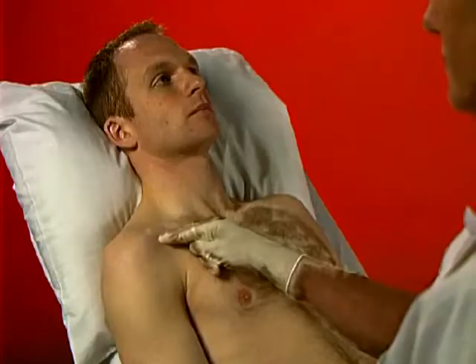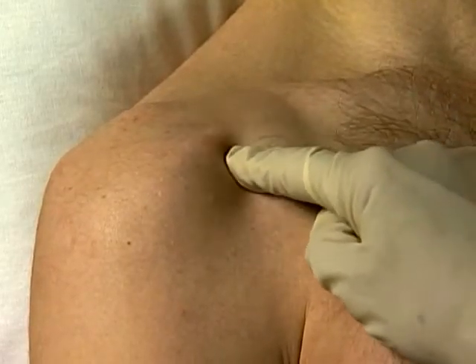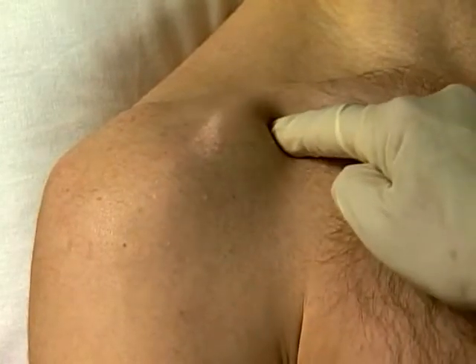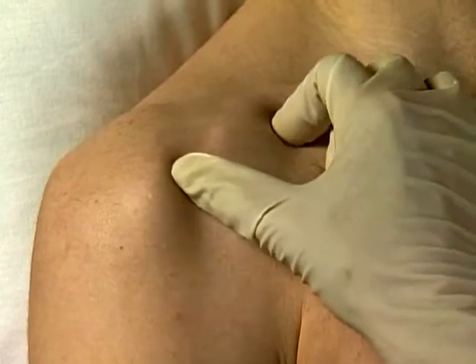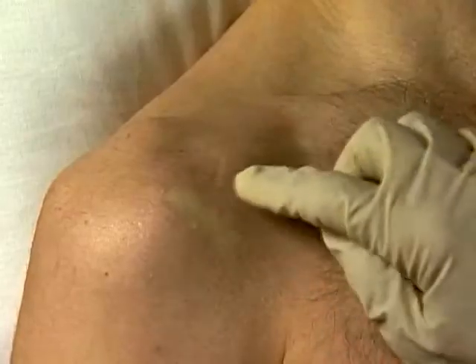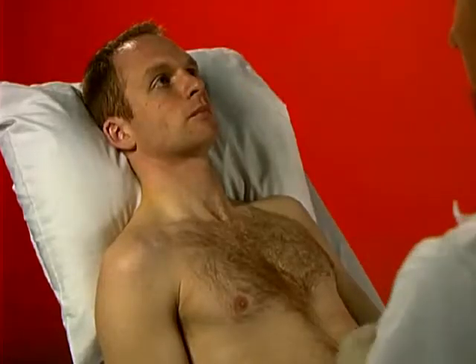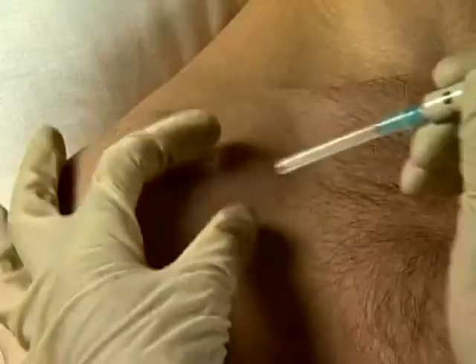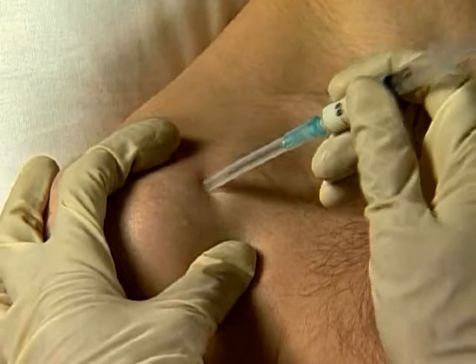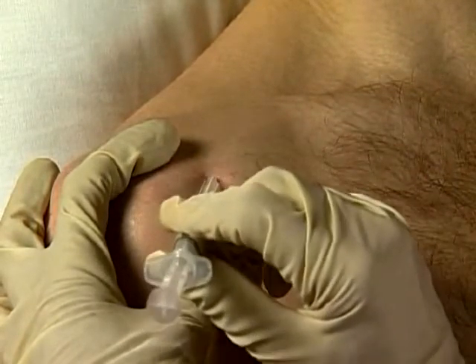3 areas can be injected from the front of the shoulder: subscapularis tendon, the bursa, and the shoulder capsule. Identify the coracoid process lying anteriorly and the lesser tuberosity on the humerus. Mark entry point immediately medial to this, clean and firmly stretch skin, and rapidly insert needle perpendicularly. Angle laterally for the tendon, posterior for the bursa, or medially to enter the shoulder capsule.